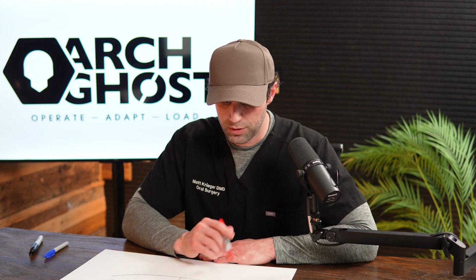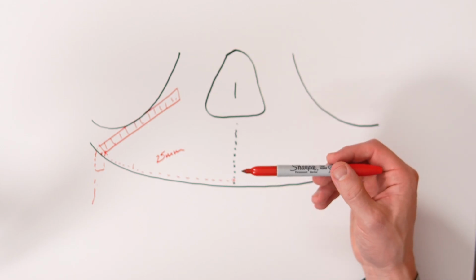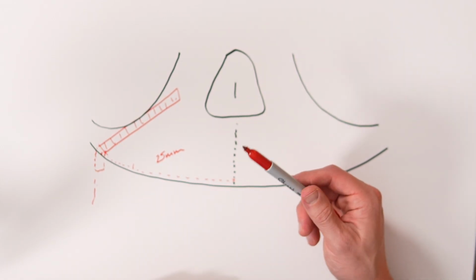And if you've seen the x-rays and things that I post with the implants right along the sinus wall or whatever in an edentulous case, this is how I do it. I'm not using a guide. I'm not poking a hole in the sinus. I'm measuring it on the pano and then transferring that measurement to the arch clinically.